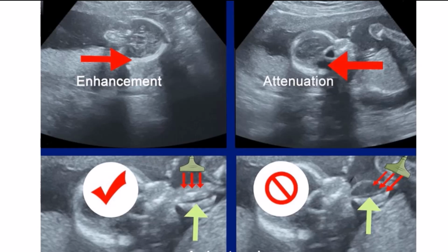Let's get a closer look at these different types of effects seen when you're using ultrasound to visualize tissues in the body.